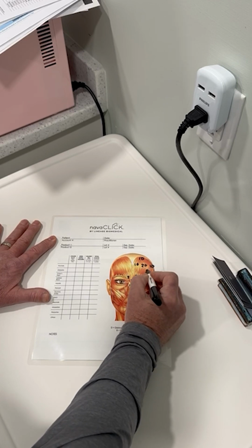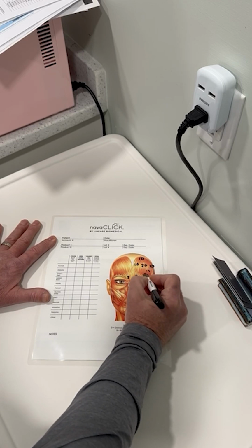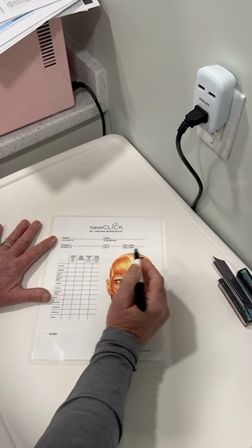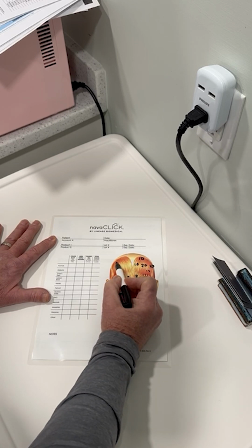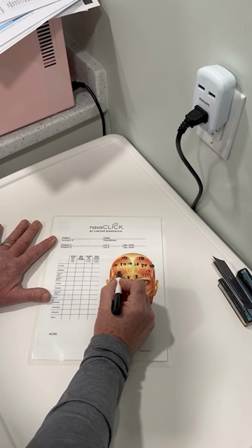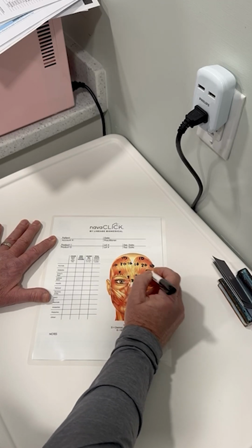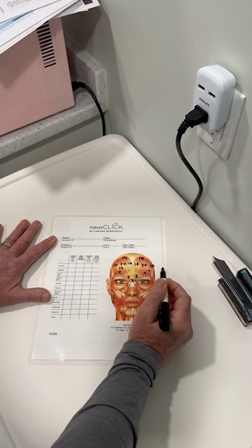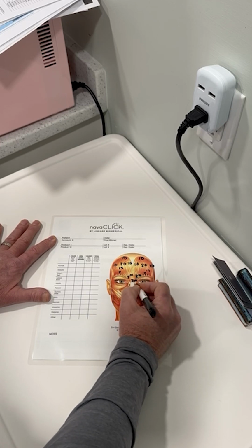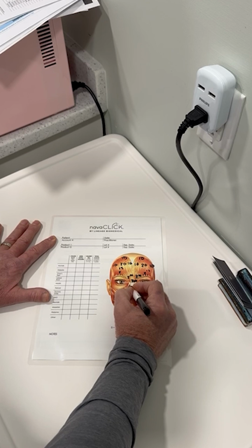And then I'm going to do 1 here, very superficial, because I get a crease right here if it's not done at all. Same thing on this side because I'm very symmetric. 1 dermal, 2 dermal, 1 dermal, 1 dermal. And to go back here, these are all superficial, and I will do 1 superficial here as well. These are all muscle. And this is technically dermal because the dermis and the muscle are directly attached.